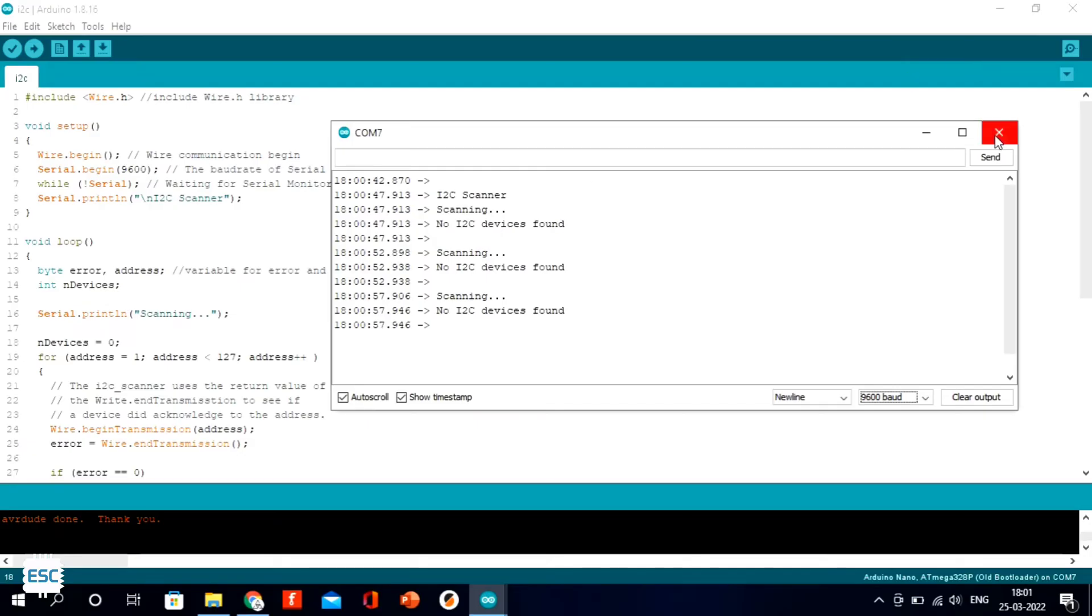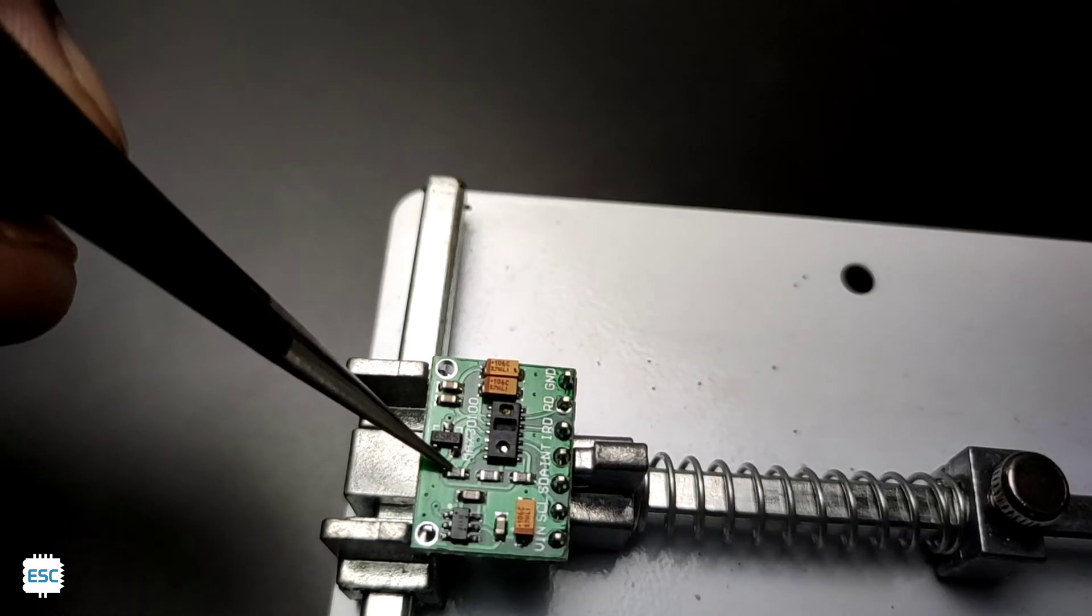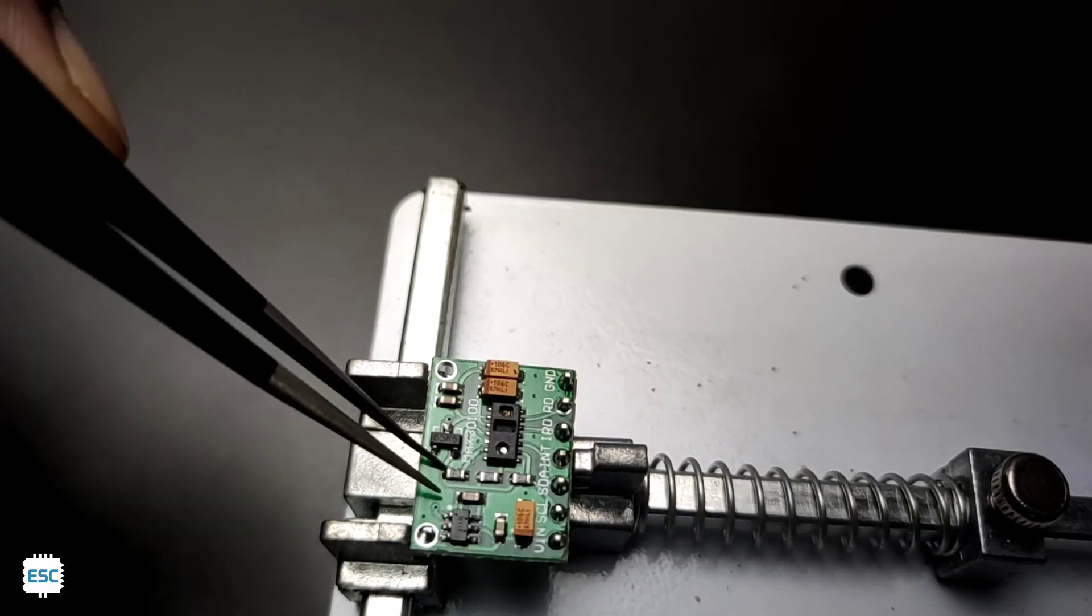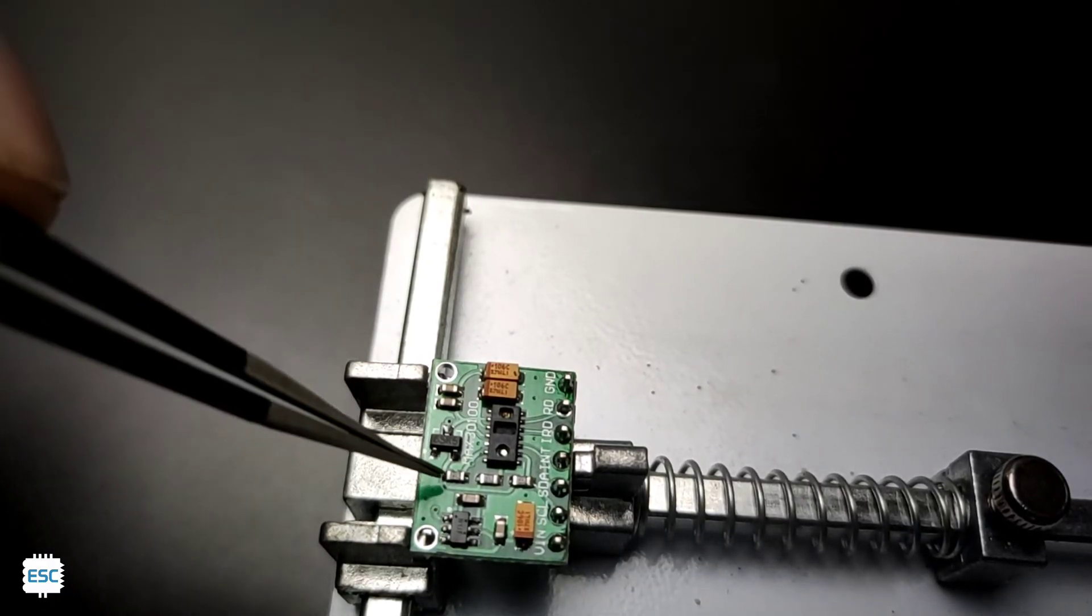So I searched on Google and I found these types of modules have a PCB error.